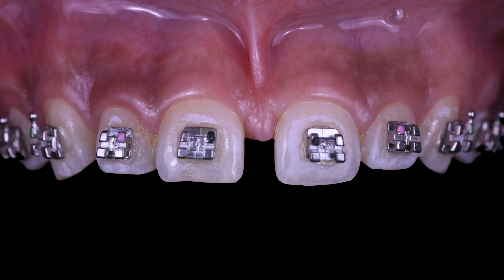So I started with the upper arch. I reversed the brackets to reverse the teeth angulation to achieve more bodily movement between the right and left sides. So I flipped the brackets horizontally. I put the upper central incisor bracket from the right side on the left side, and the same for the laterals. That will achieve negative angulation that will give more bodily movement during closure.